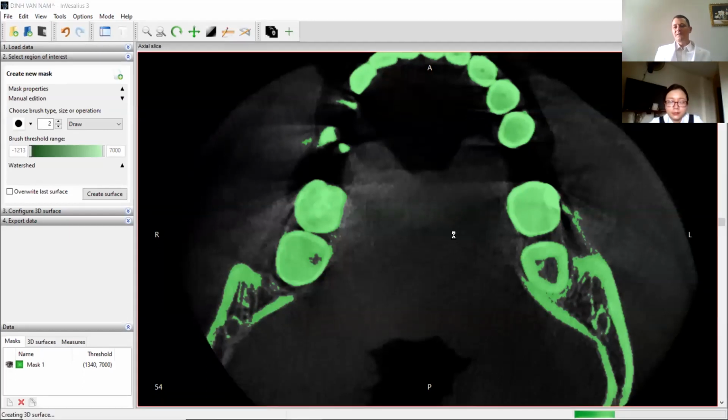For those who are really interested in doing things like this, 3D Slicer allows you more options. It's another free software. More complicated to use because it can do many things, but it can also do things more complicated than this one.